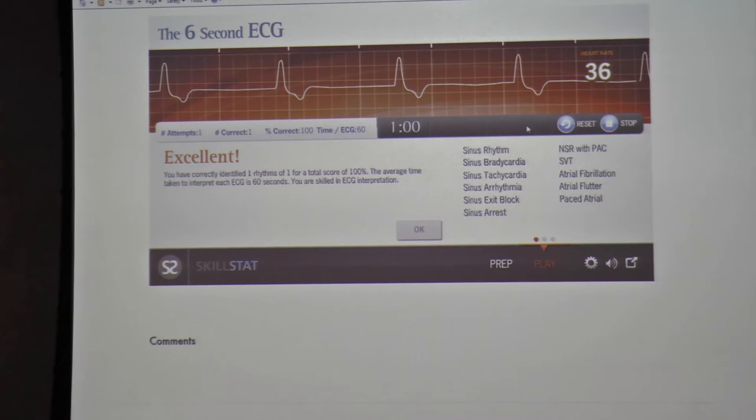Okay, so this one probably would have been what? So we said it's ventricular, rate of 36. So it can't be VTAC. And it's within the normal 20 to 40 of the ventricle, so we're going to call it idioventricular, not accelerated idioventricular. Let's see if it starts up again with that one. We could get another 100.